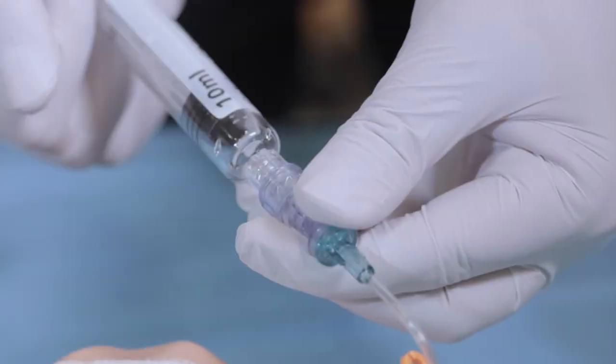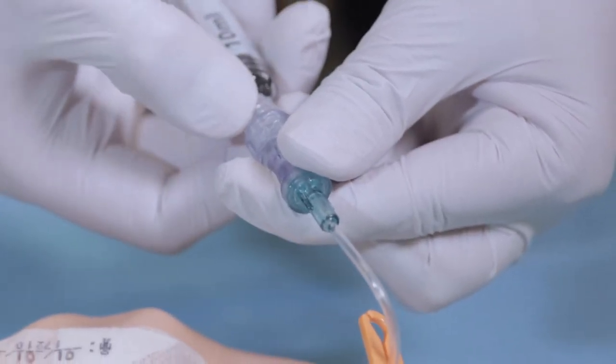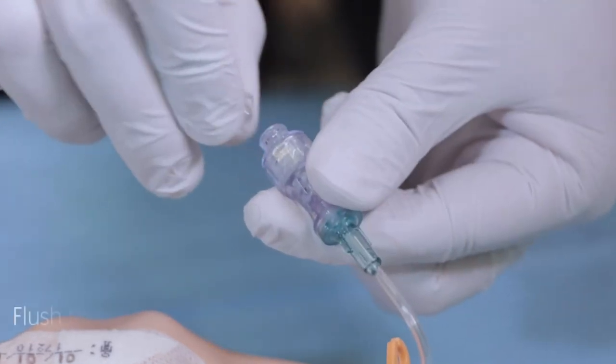Step 4. Administration and removal. For added security, hold the syringe and the VADSight together while administering the drug. Unscrew the locking collar anti-clockwise to remove the syringe.